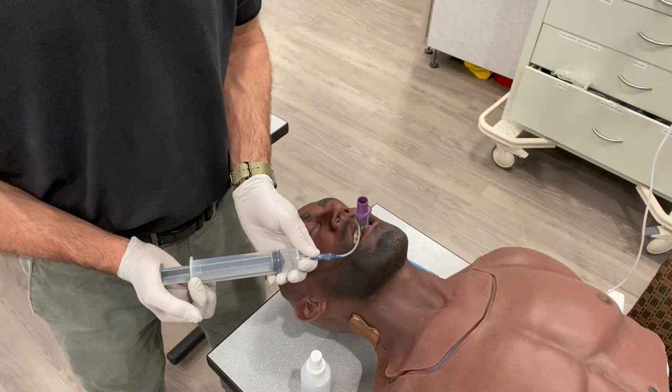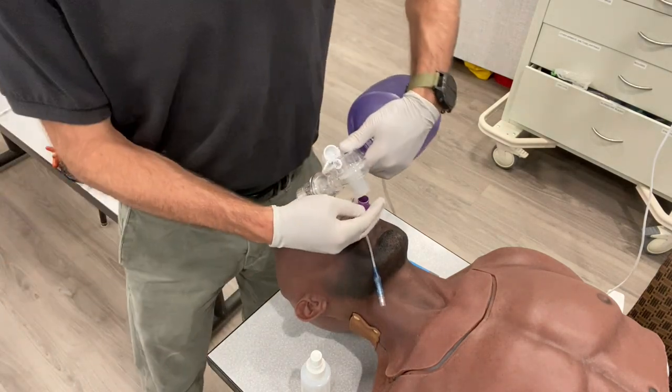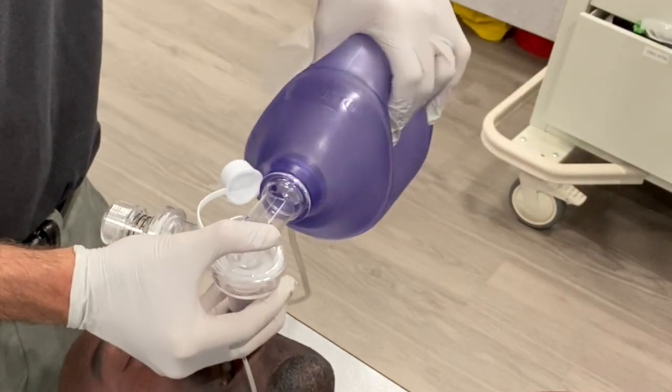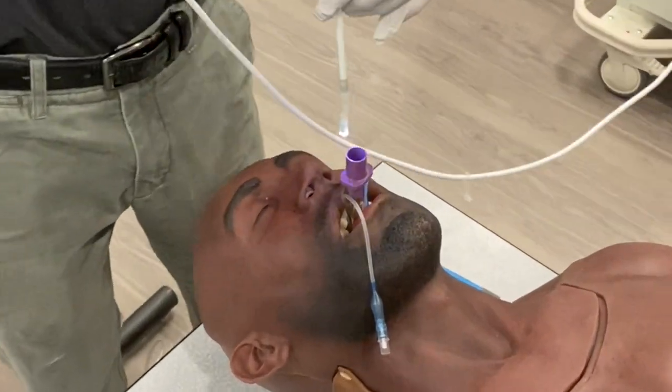So we propose a better method. An appropriately sized King Airway is placed in the usual method in the esophagus and the balloons are inflated. The patient is ventilated and resuscitated. The flexible fiberscope is then placed into the main lumen of the King Airway and guided to the side port which abuts the larynx.